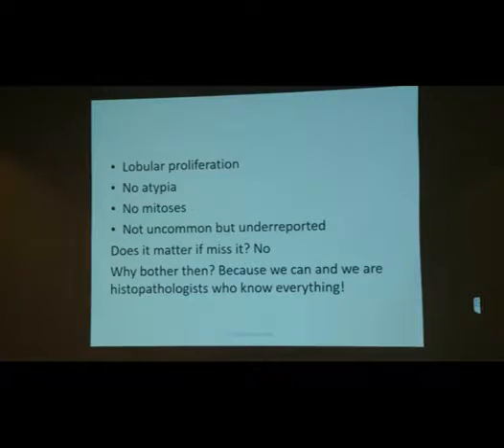Does it matter if you miss it? Absolutely not. It's a benign condition. So why should we bother to look for it? It's because we can. And we're histopathologists and we know everything. So we'll just tell the clinician, yeah, that's Bartholin's lobular hyperplasia. Okay?